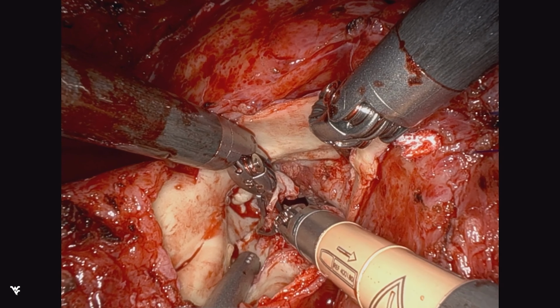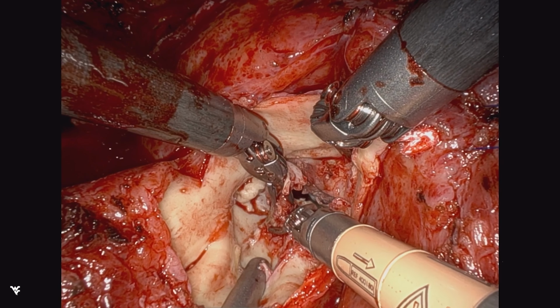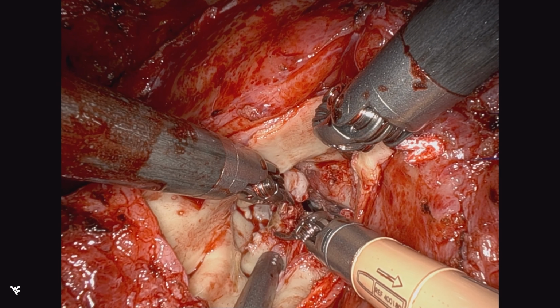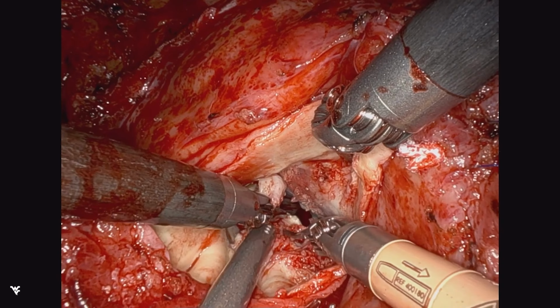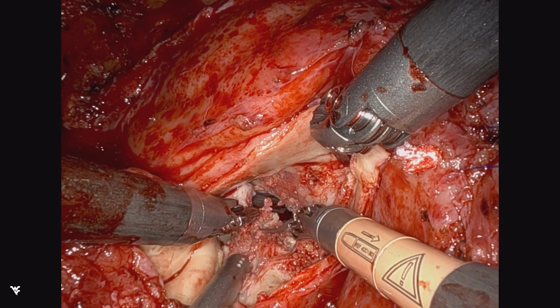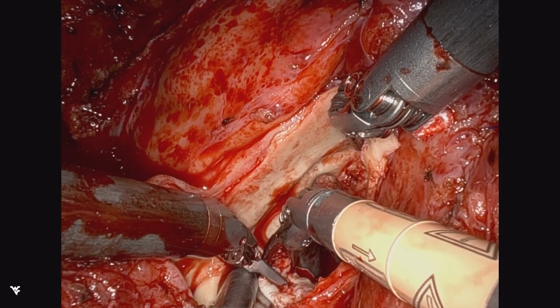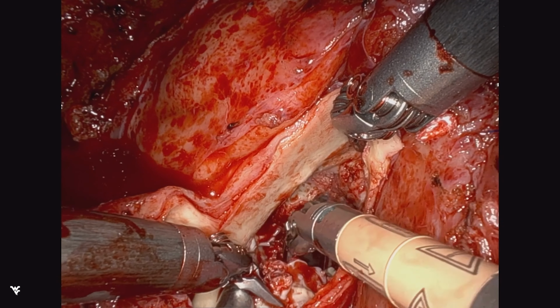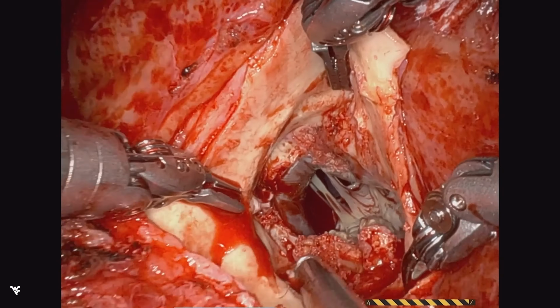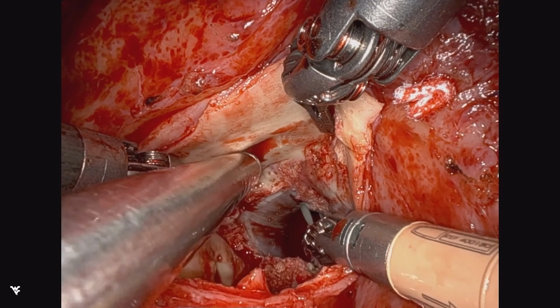So now we go back to the left. You can see it's encroaching on the aortic wall here. So now it's time for some choices, because as we get close to the coronary ostia, it can become somewhat precarious in that the coronaries can get involved. So got to make some choices here. There is the pursuit of total calcium debridement, but then there's also safety and judgment. And in this case, I'm going to debulk as it pertains to the left ostia.